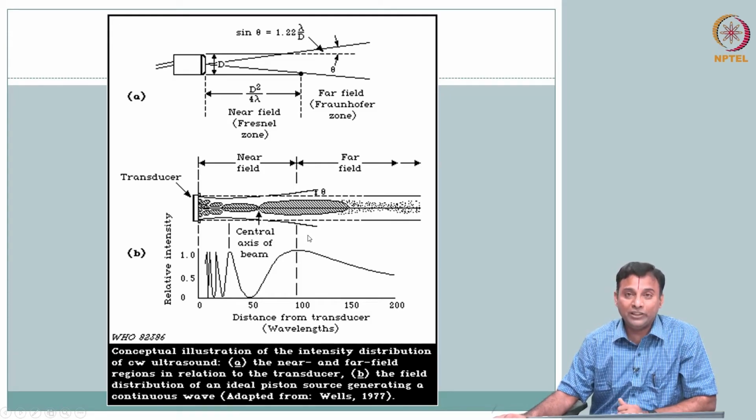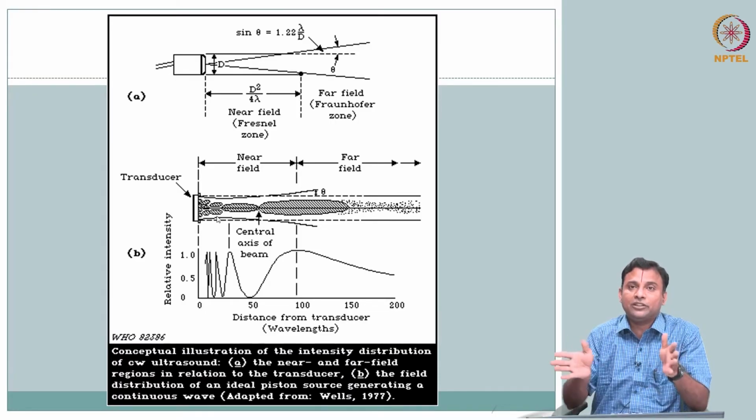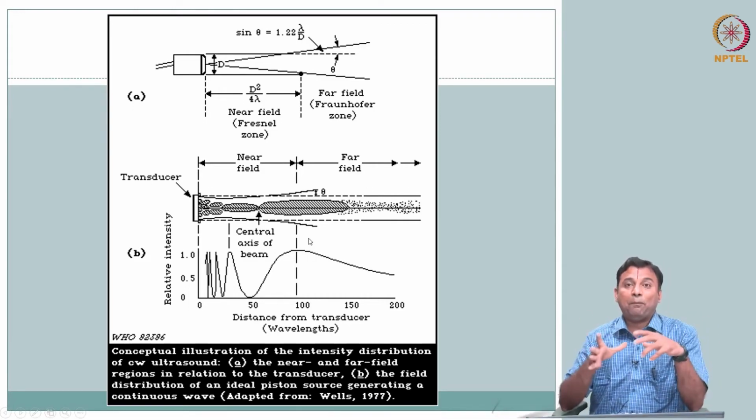So, when we do imaging, if you are just doing one dimension, this is okay. We know depth, thickness, crystal, lambda determines your axial resolution. But then the challenge in imaging is you have the other dimension. So, how does this wave spread in, at least, the imaging plane?